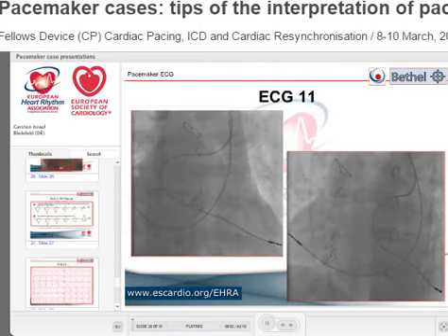Let's look. I think I have the X-ray. That was a very funny implantation. I was using the left arm. The first thing that happened, I was going straight across the lung. And then I found a funny vein. So obviously a persistent left-sided superior vena cava, okay. Going here, this must be the coronary sinus.